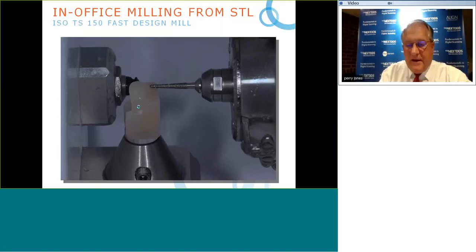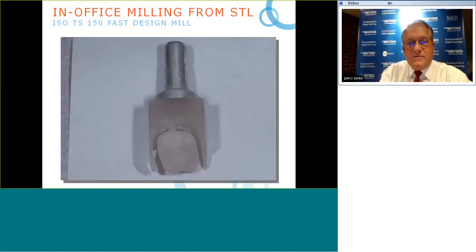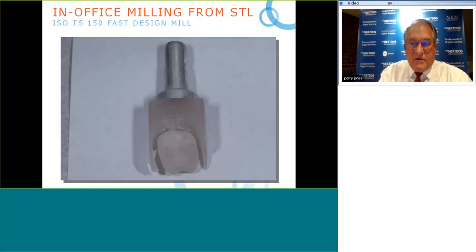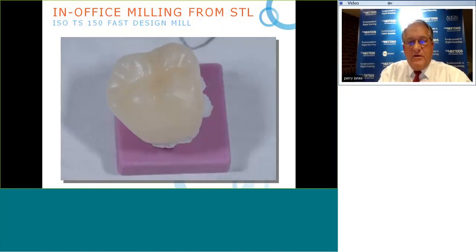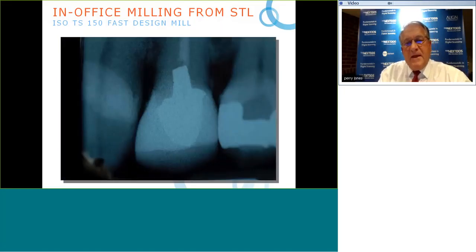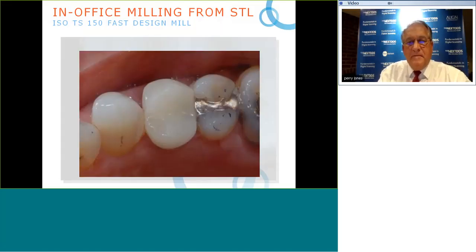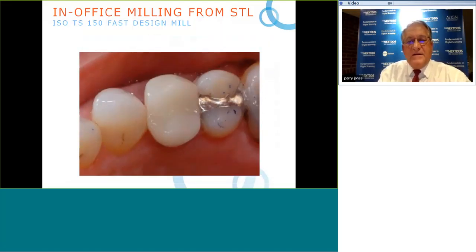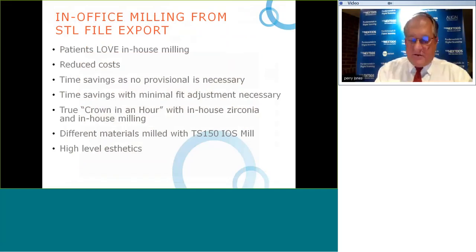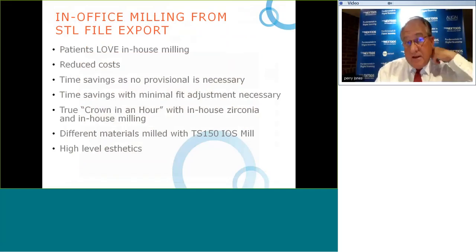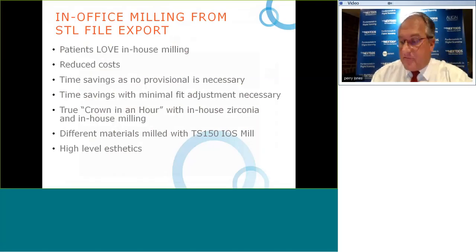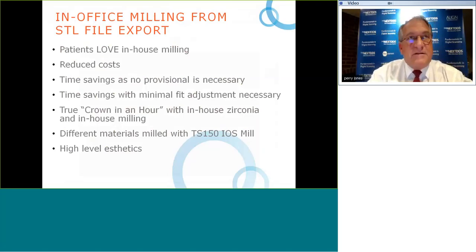Here's a close-up of the bur milling from a lithium silicate blank — it doesn't look like a tooth yet because it hasn't been sintered; the color changes in the sintering oven. Here you can see a crown with very nice margins, and that crown placed in the patient's mouth. In-office milling has come a long way quickly — in-office zirconia milling has only been around since late 2015.